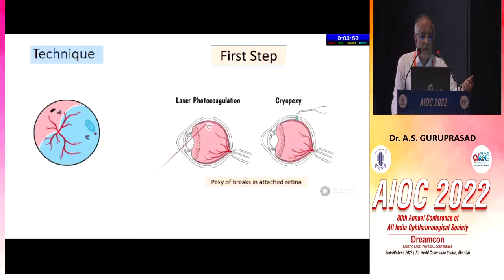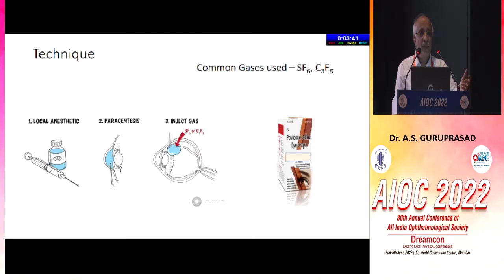So, technique. The first step is to do laser photocoagulation and cryopexy to the breaks in the attached retina. So this is very important. Maybe it can be done a couple of days before the actual procedure of pneumatic retinopexy.